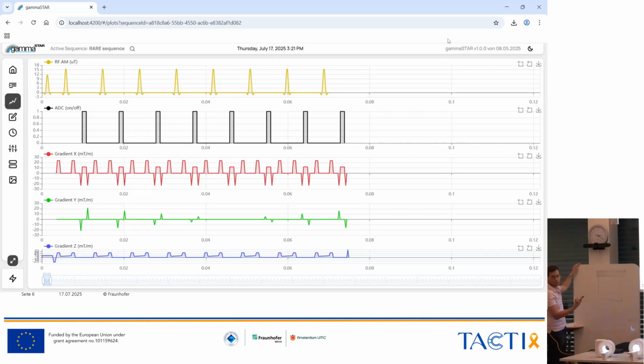If we then continue, we can think about the next excitation, with the first line being here. At that position, we have a very strong intensity jump in K-space, and we also have that here, here, and here. So we introduce, let's say, 6 different segments in K-space.